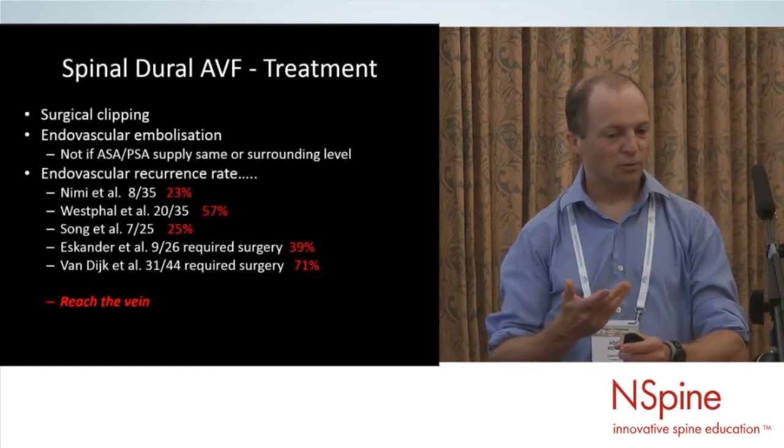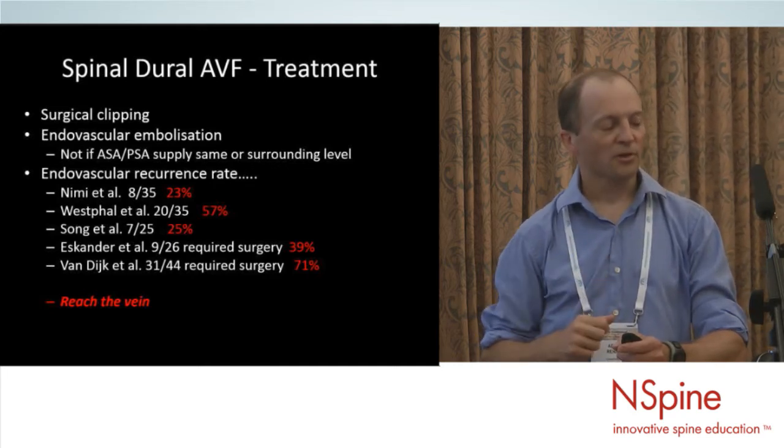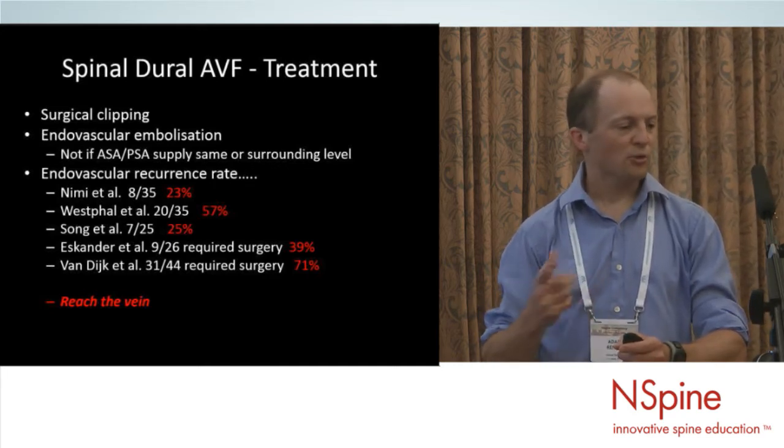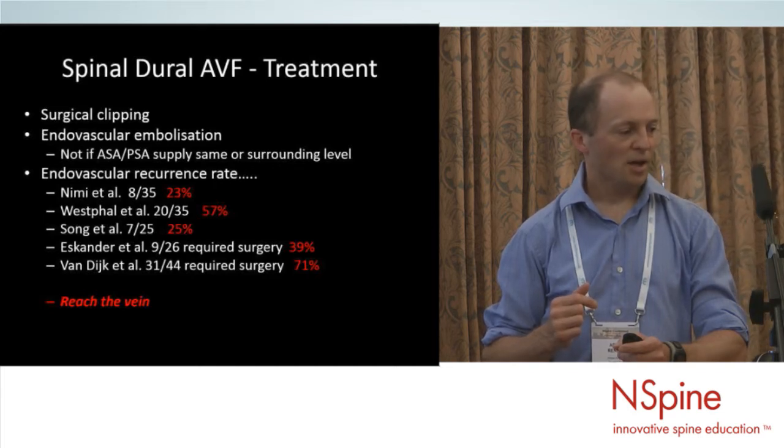And if you don't do an adequate job, if the vessel blocks and you can't get any more catheter forward, you can lead to a situation where it will come back, and that leads to a slightly higher rate of recurrence with the Onyx.